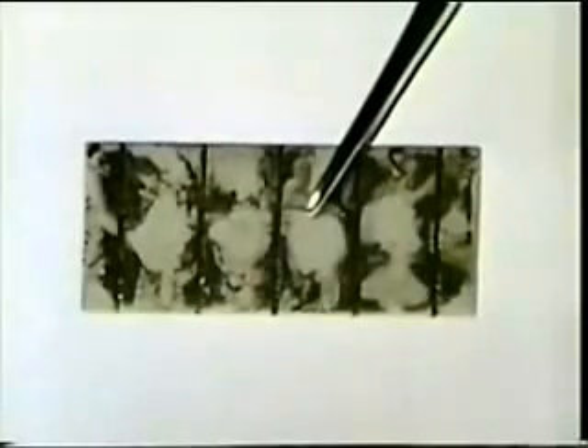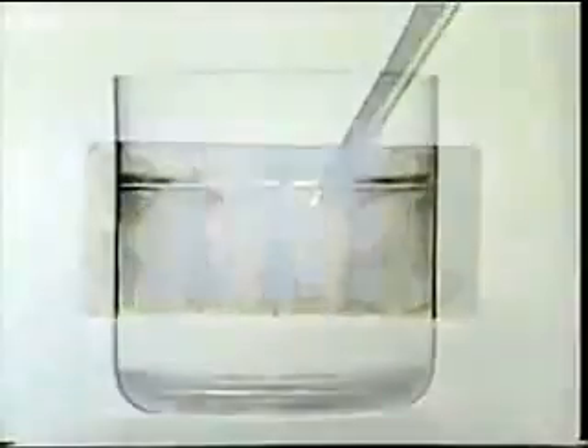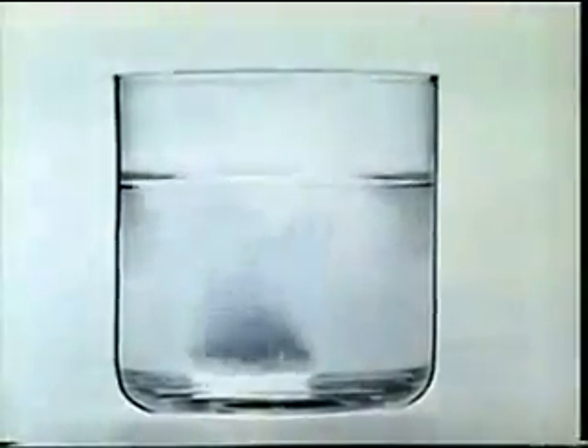Look, here is a block of denture material. It has been badly stained with food. Now watch what an Everdent tablet and warm water can do.